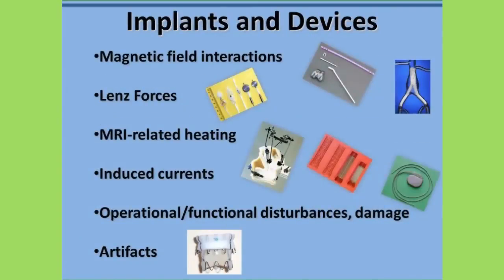The preservation of a safe MRI environment requires healthcare professionals to be particularly attentive to the management of patients and individuals who have implants and devices. For this reason, a considerable part of the MRI screening procedure involves identifying the presence of these items. For patients, MRI procedures may be contraindicated primarily because of problems associated with movement or dislodgement of a ferromagnetic implant or device.